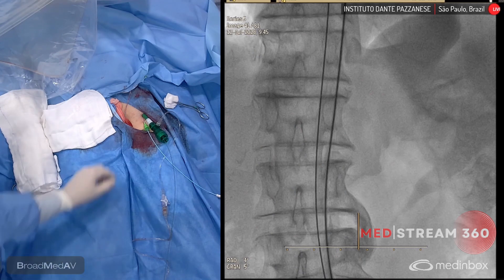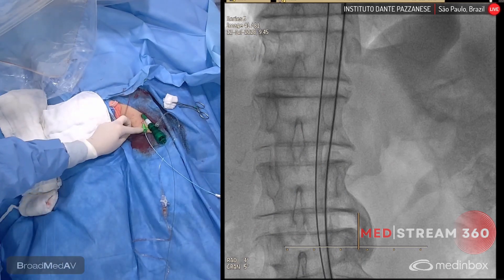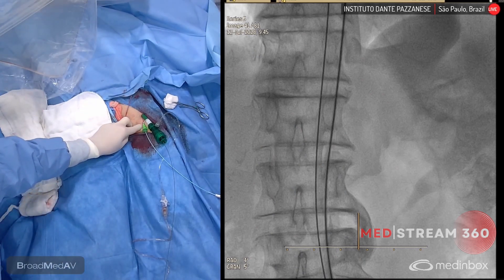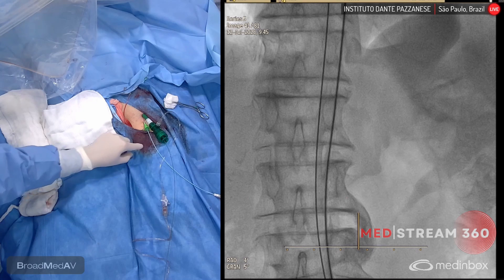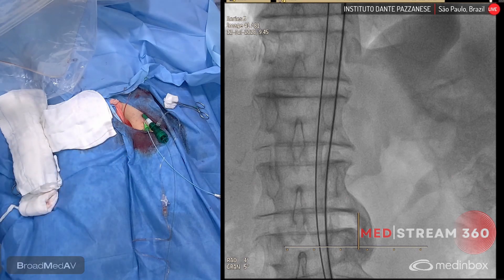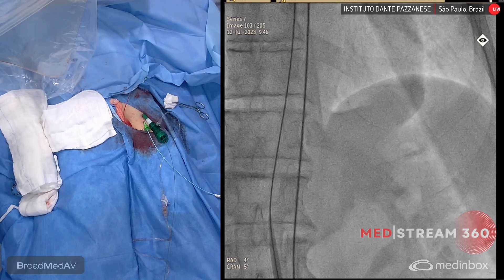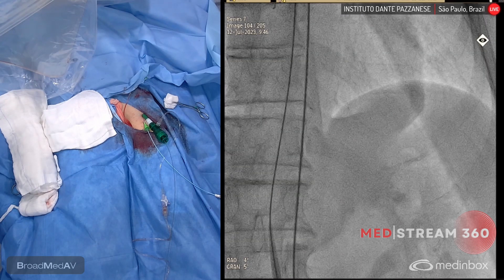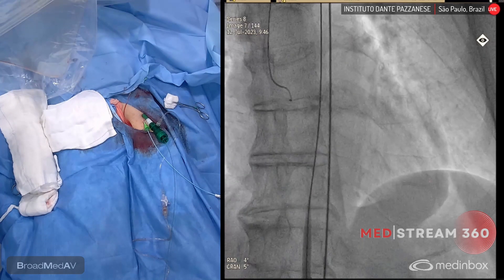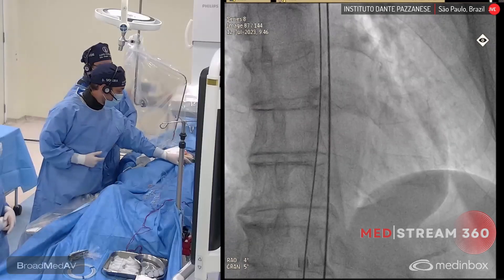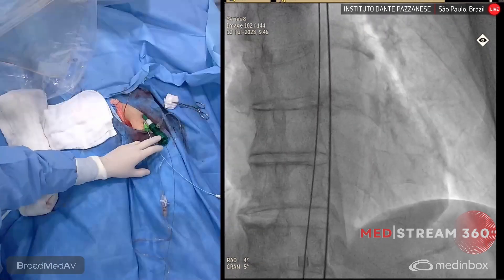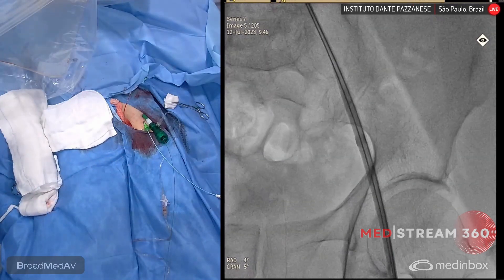We placed a long 6 French sheath on the secondary axis with a pigtail and inside the pigtail a stiff Lunderquist wire. We were then able to place the large-bore 14 French Python sheath without any difficulty.